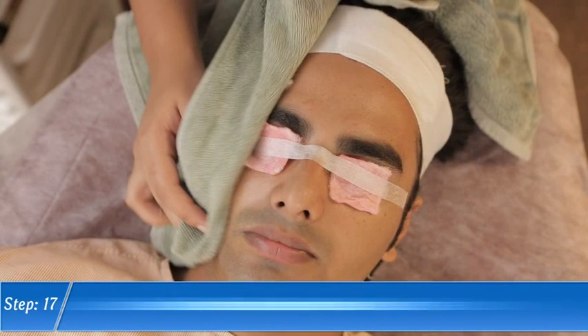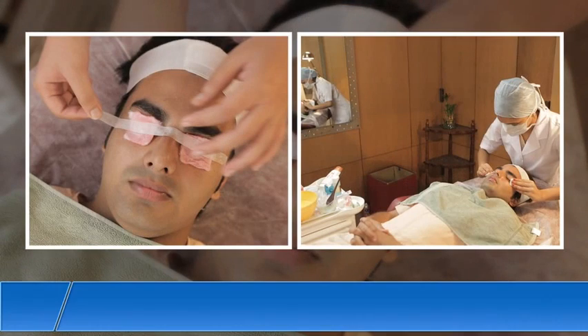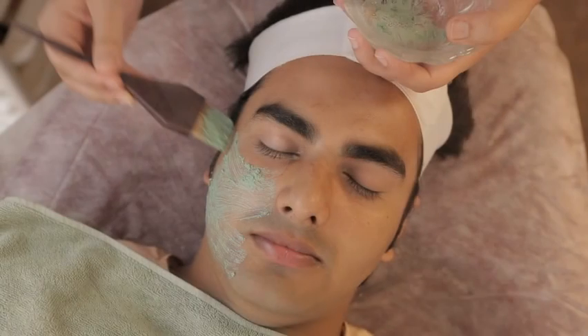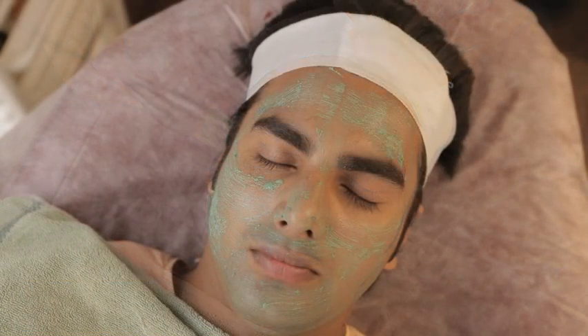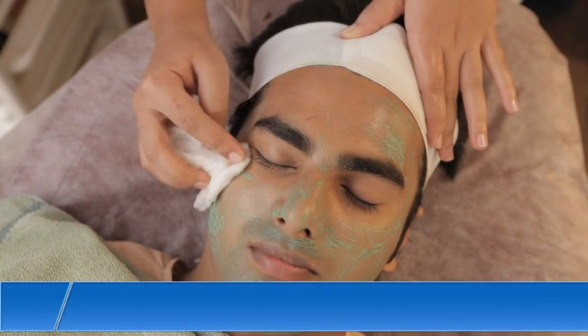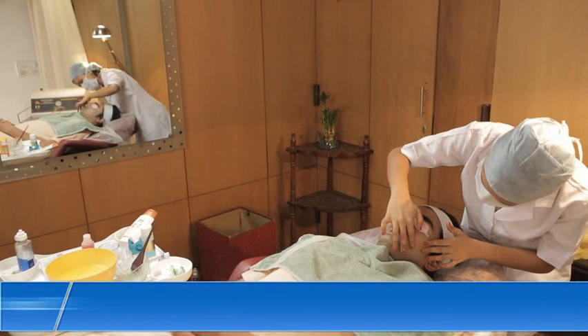Step 16. Switch off the machine when the timer goes off. Step 17. Clean the client's face with a wet towel. Step 18. Remove the eye pads and clean the eyes with wet cotton balls. Step 19. Apply a thin layer of face pack with a face pack brush. Step 20. Wait for 10 minutes and check if the pack has dried. Step 21. Remove the dried pack using lukewarm water and cotton balls.